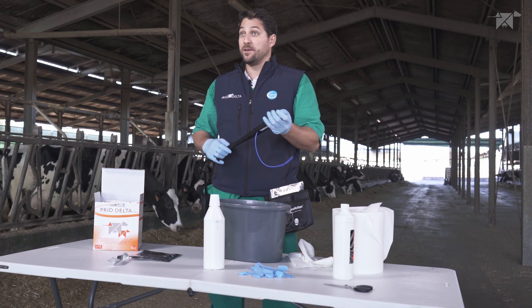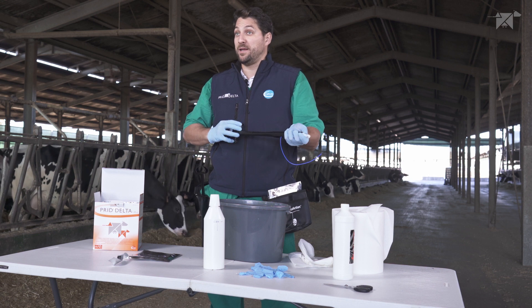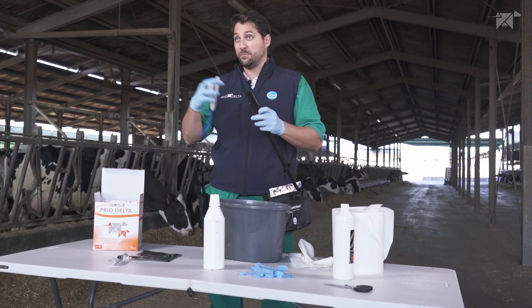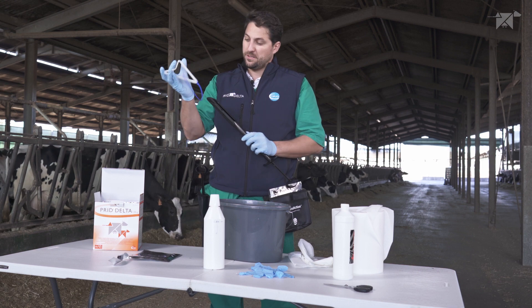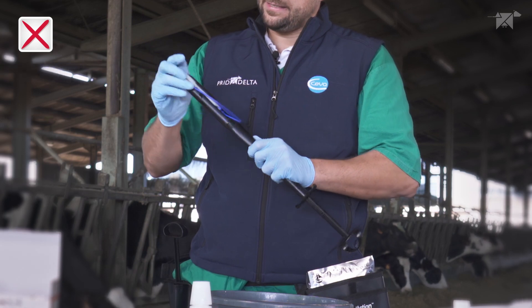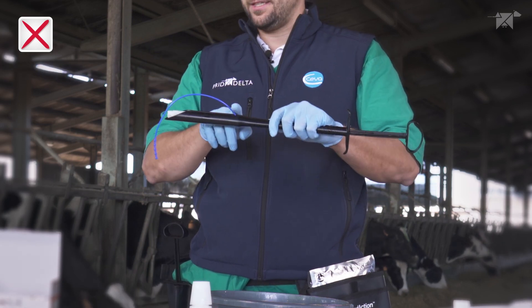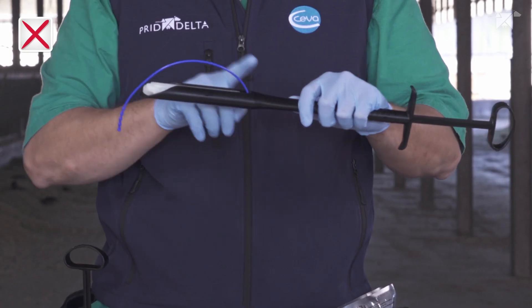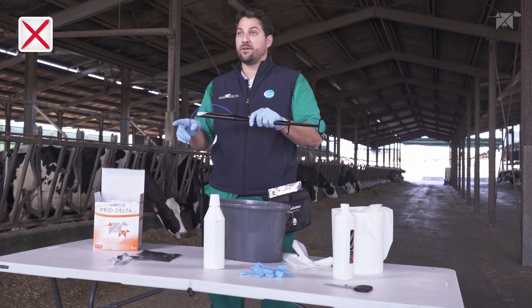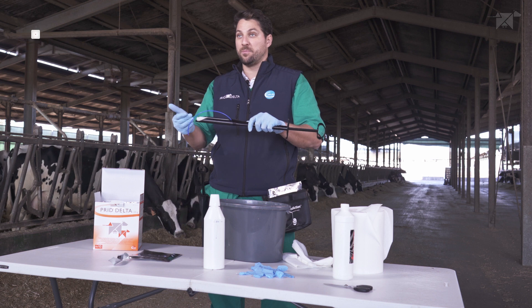Now I'm going to show the non-correct ways of applying the Predelta device. If you are introducing the Predelta device in the wrong direction — with the 90-degree bend wrongly oriented — you're going to find the tail of the device directing towards the tip of the applicator. This is the wrong way to apply the Predelta device, and we should avoid this.